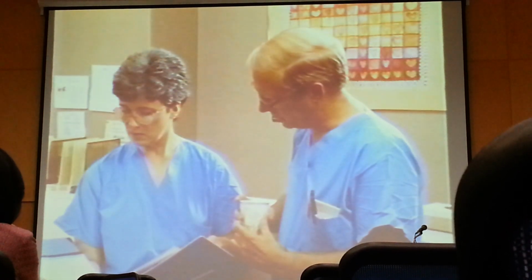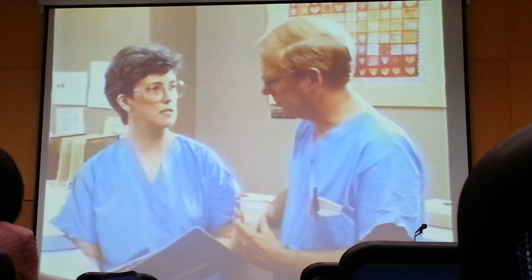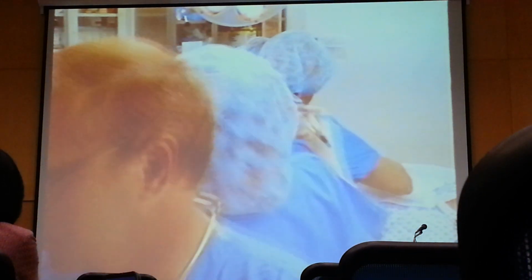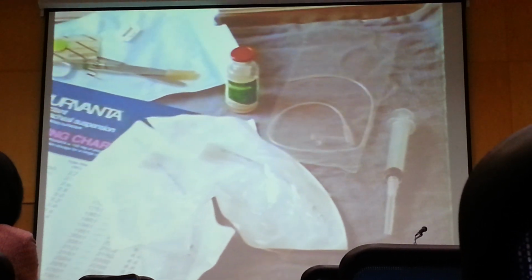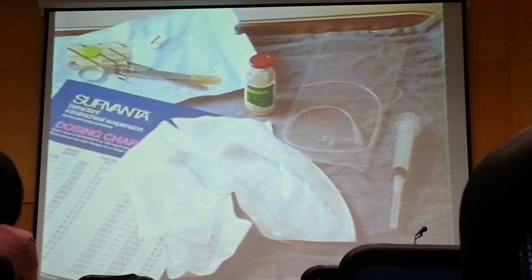This begins with a review of maternal records before delivery. They've just finished the ultrasound, and the ultrasound is consistent with the dates, 26 weeks. Candidates are infants at risk for RDS, typically those expected to weigh less than 1,250 grams. Larger infants with prenatal evidence of surfactant deficiency may also be treated. In the delivery room, have ready a syringe and 20-gauge or larger needle, 2 endotracheal tubes, a 5 French end-hole feeding catheter and a sterilized cutting tool, and a room temperature vial of Surfactant.